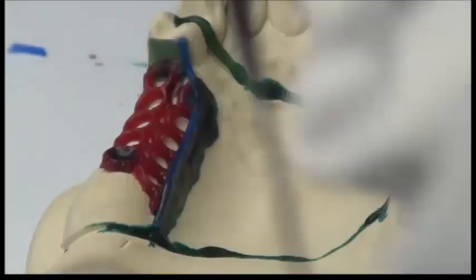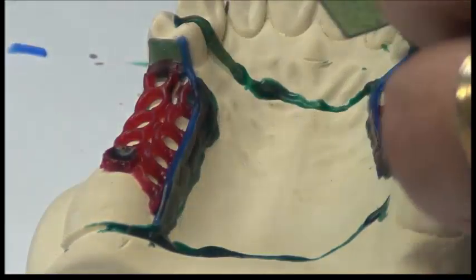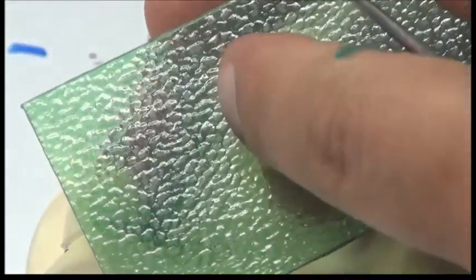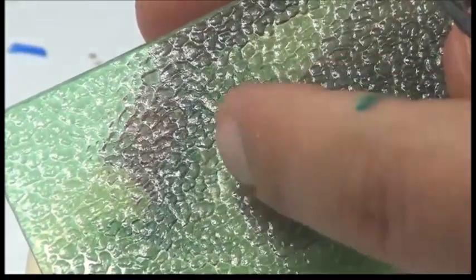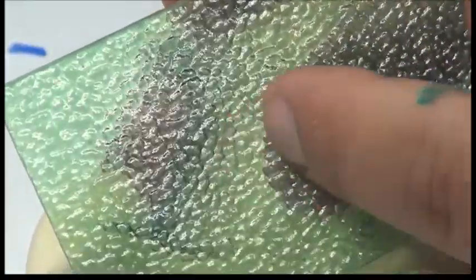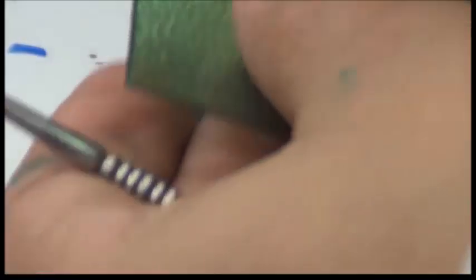And for this, I'm going to use a wax pattern that has the shape of the palate. It's a gauged wax. It has a specific gauge, it has specific dimensions. But not only that, you can see when it's shining, it's a bit rough on one side. This is to mimic the roughness naturally present in the palate. The palate is not totally smooth. It has some surface structure, and this is mimicked here. So we have a rough surface and a shining surface. The shining surface is the one that is fit on the palate of the patient. This one we leave upwards.